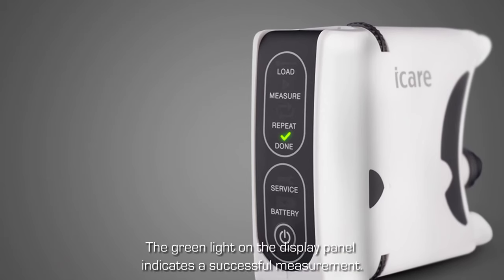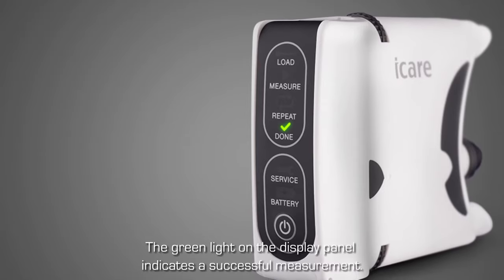After a successful measurement of eye pressure, the display panel will show a green light.